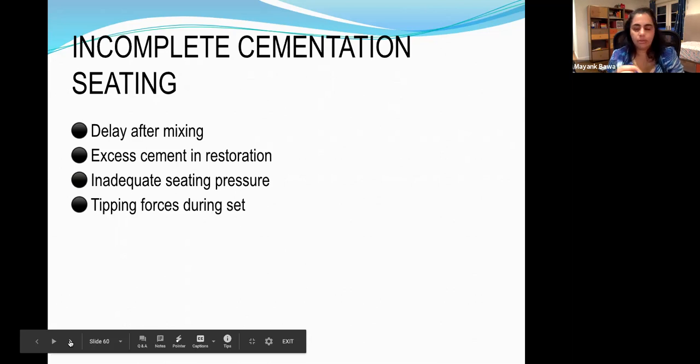The crown is like a trough, right? If you were to just line the crown with the cement, do a little bit more than that. If there's not enough excess, then it's very easy to clean it out, but it should not be less. So definitely err on the side of more than less.